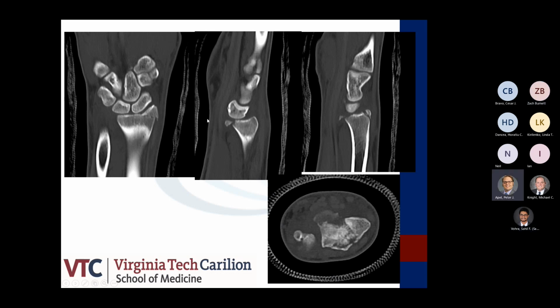Can I make a comment real quick? Yes. You've got to resist the urge to just throw a dorsal bridge plate on this. This is a globally unstable radiocarpal dislocation, and they're extremely powerful devices, and they can pull you dislocated off the other direction really quite easily. I don't know if this was my case or not, but the inclination is to say, oh, I'm just going to put a bridge plate on this. But that can actually be a very challenging case because of the global instability.